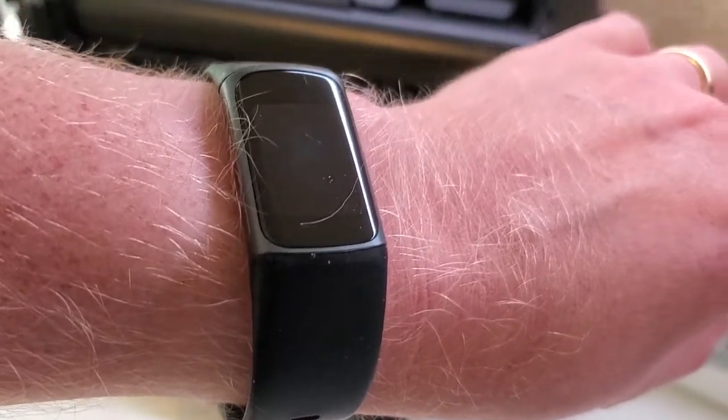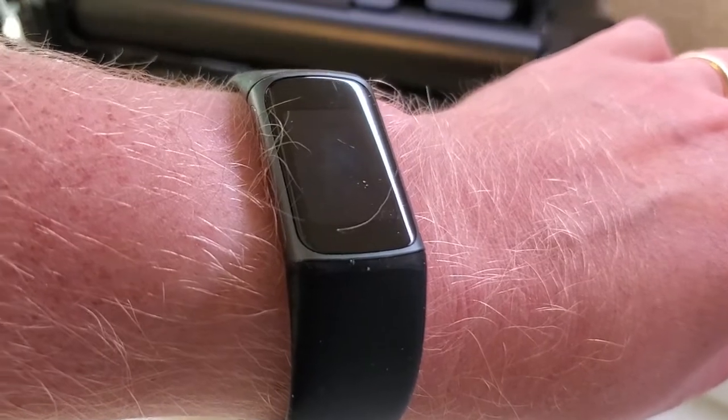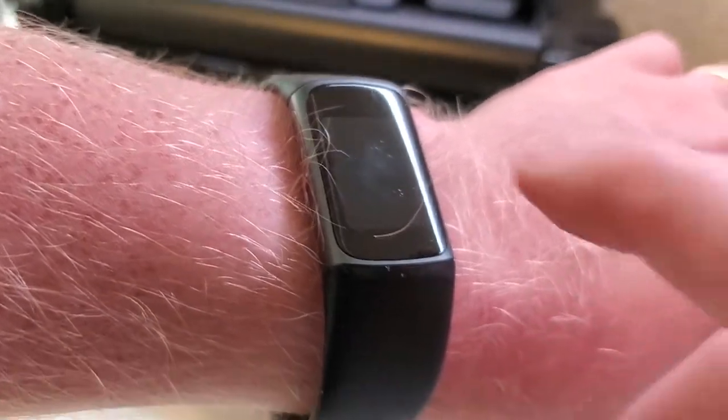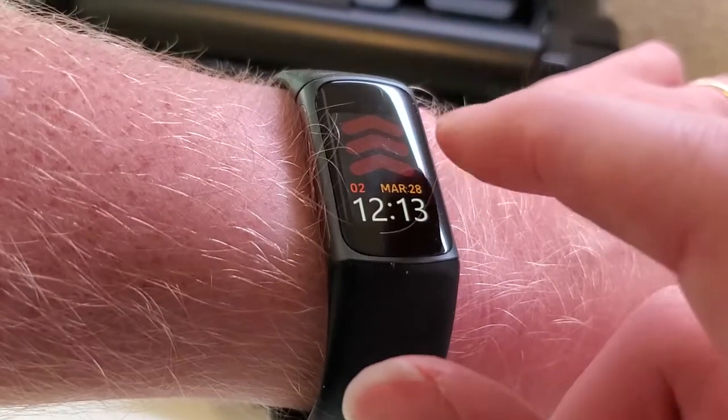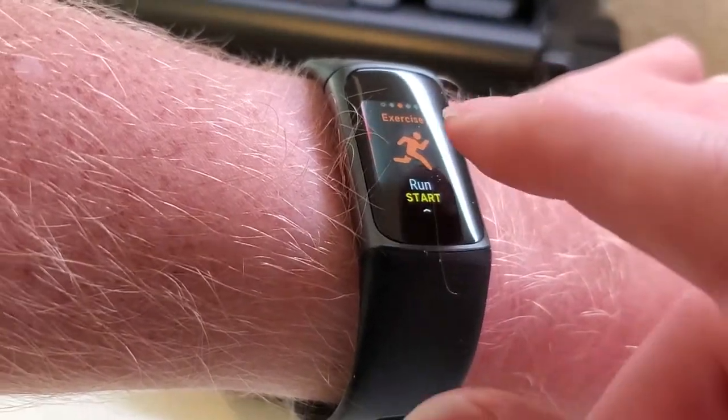This is one of the really cool features of the Charge 5 watch. It actually has a FDA-cleared ECG feature built in that you can use to take an electrocardiogram, and that can help to diagnose certain heart arrhythmias, for example, AFib.